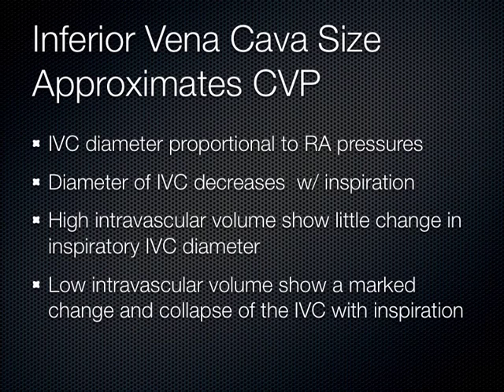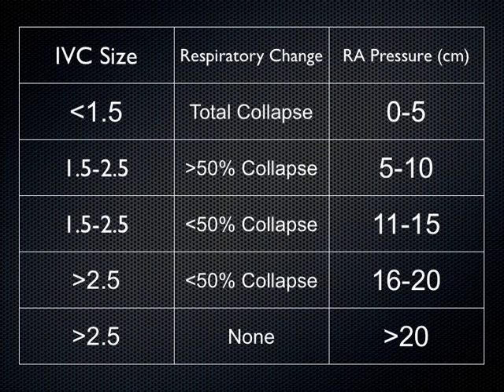And that's especially true when you have patients who are in shock, like septic shock. And so that's where this all kind of will play in for you later in your clinical years. But I just want to give you that sort of preamble right now that you can actually estimate the right atrial pressure non-invasively by looking at the diameter of the IVC and how it collapses during inspiration.